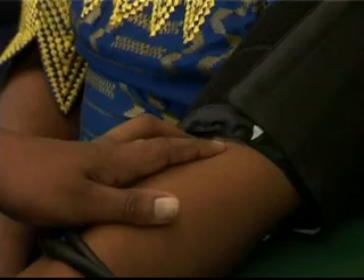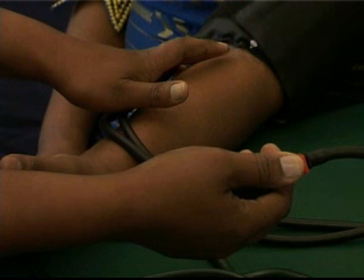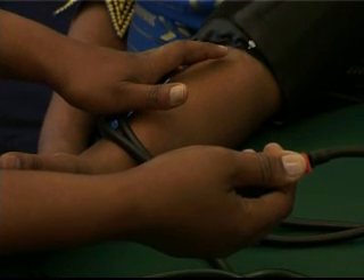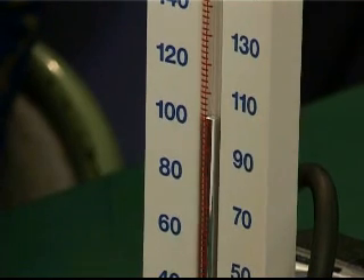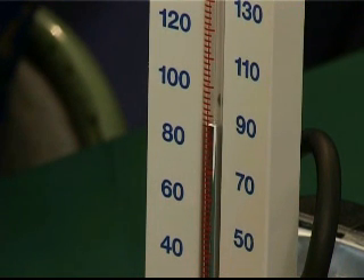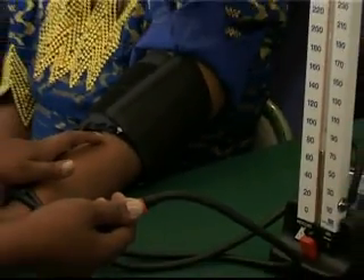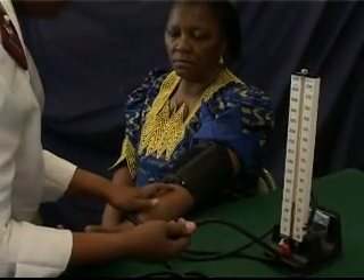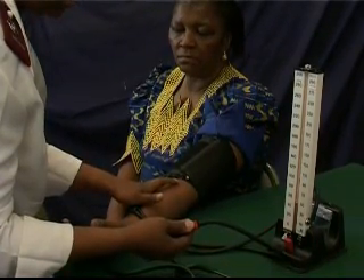Palpatory estimation of blood pressure: The brachial artery should be palpated with the fingertips while the cuff is rapidly inflated to about 30 mmHg above the point at which the pulse disappears. The cuff is then slowly deflated while the clinician notes the pressure at which the pulse reappears — this is the approximate level of the systolic pressure. Palpatory estimation is important because the phase 1 Korotkoff sounds sometimes disappear as pressure is reduced and reappear at a lower level. This is called the auscultatory gap, resulting in systolic pressure being underestimated unless already determined by palpation. The palpatory technique may be useful for patients for whom auscultatory endpoints are difficult to judge accurately, such as pregnant women or patients in shock.